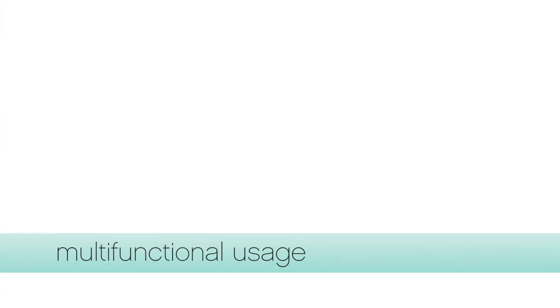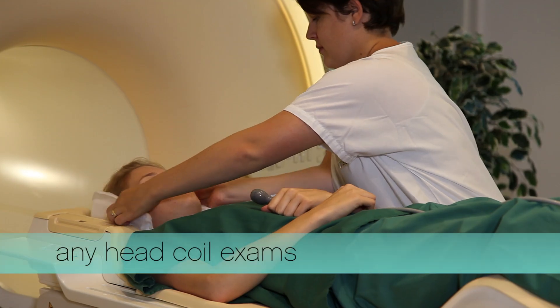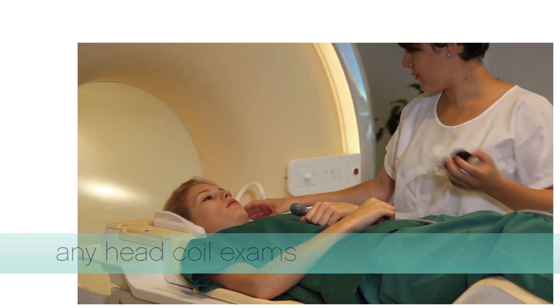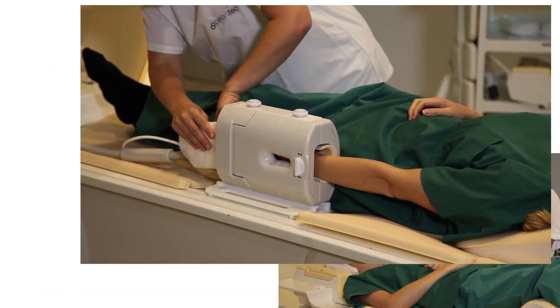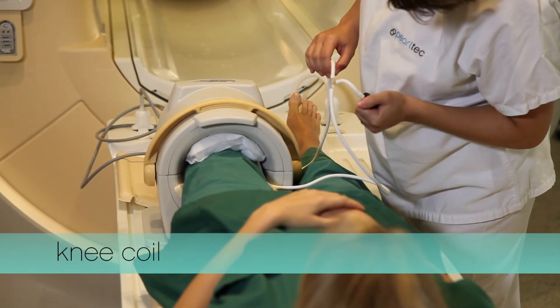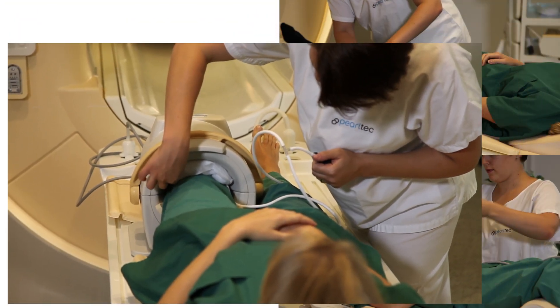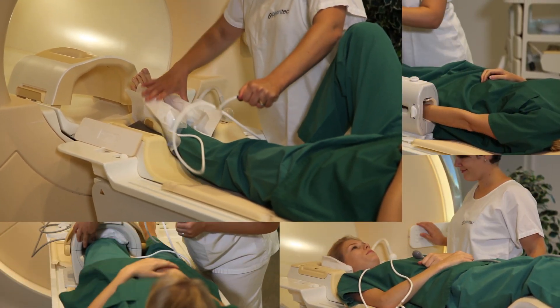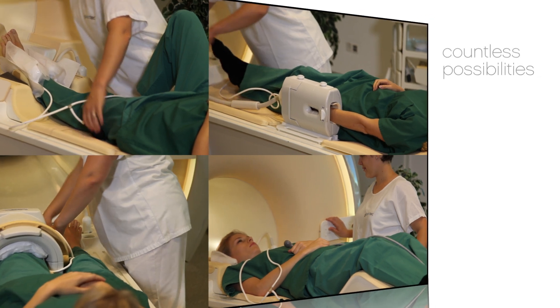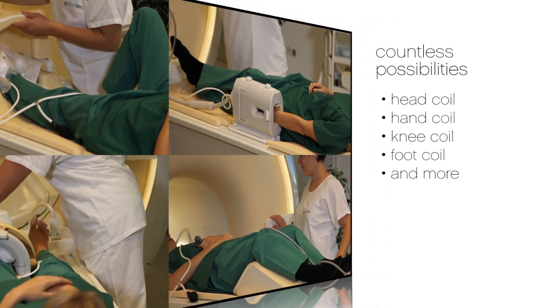The multi-pad product can be used in a wide range of MR and also CT exams. Here are a few examples of the exceptional versatility. The pads can be used in any head coil exam, in hand exams for finger stabilization, in knee coils for leg stabilization, or in setups for foot examinations. The pads offer you countless possibilities with one system.